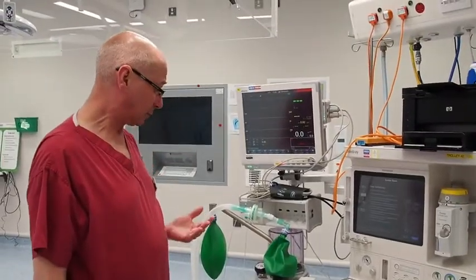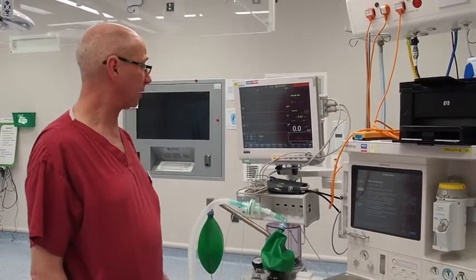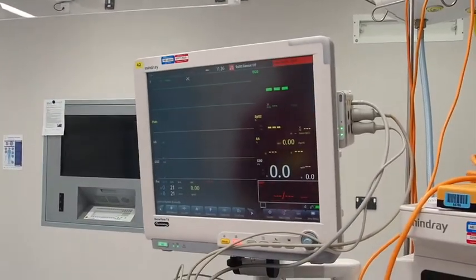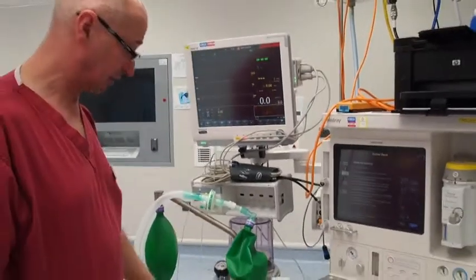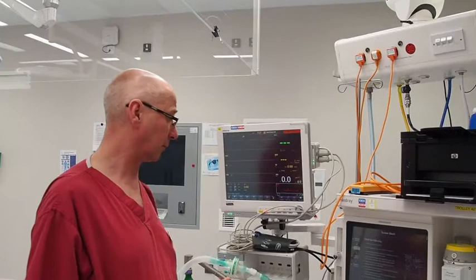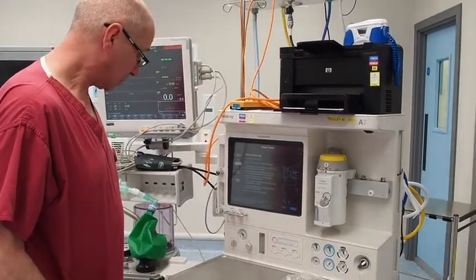You know when the soda lime is starting to run out, because your inspired CO2 level will start going up, and once it gets up to about 0.71 kilopascal, you want to be changing the soda lime. But there will be anaesthetic department practitioners around who will look at this for you. And then we've got an O2 flush to check.